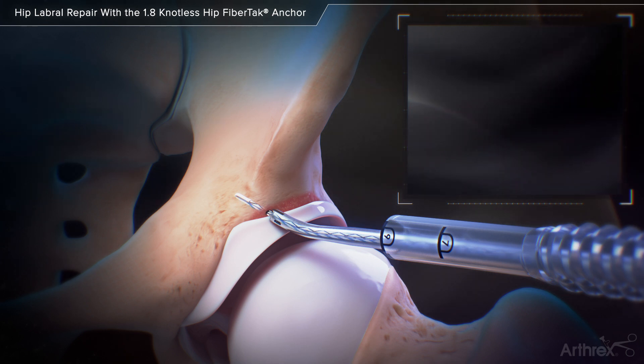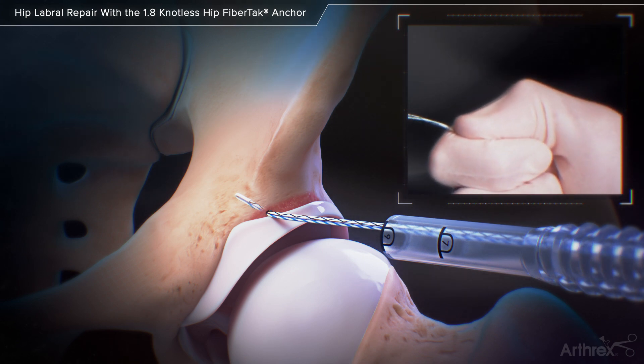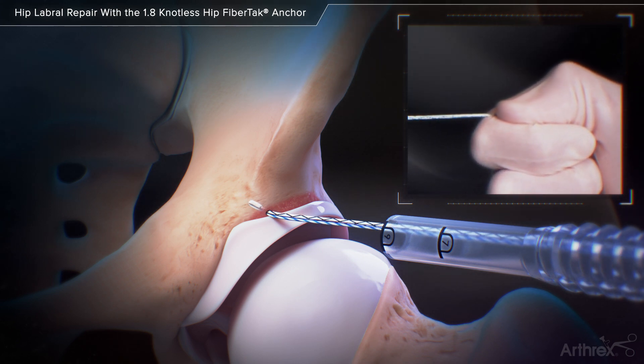Remove the handle and the drill guide from the cannula. Slowly pull all of the sutures to set the anchor in the bone socket.